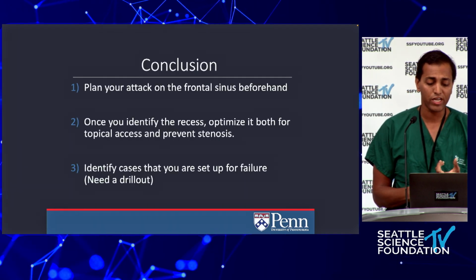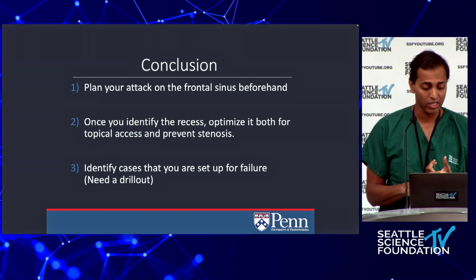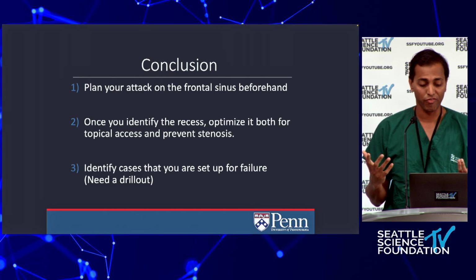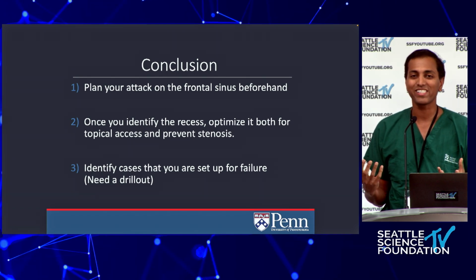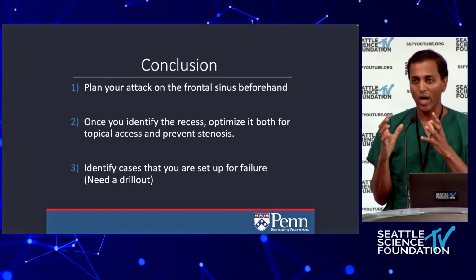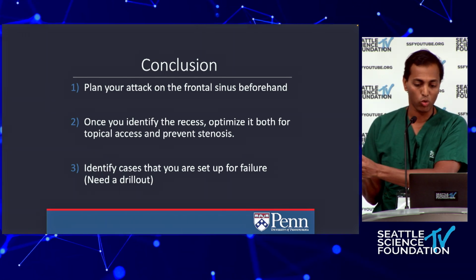So in conclusion, plan your tact on that frontal sinus beforehand. Once you identify that recess, optimize it both for topical access and to prevent stenosis, and then identify cases that you're set up for failure, because those are the cases where you want to think about whether you want to go after them in your traditional way or be more aggressive.